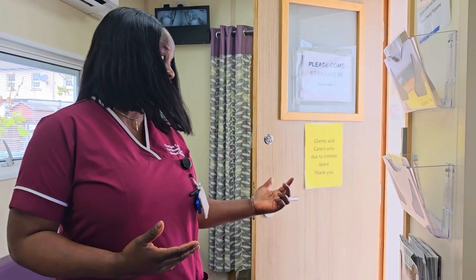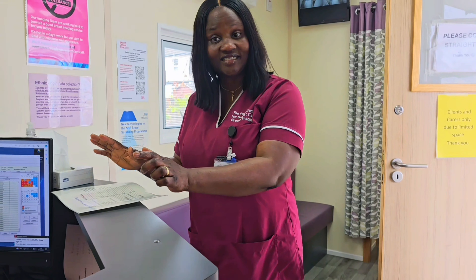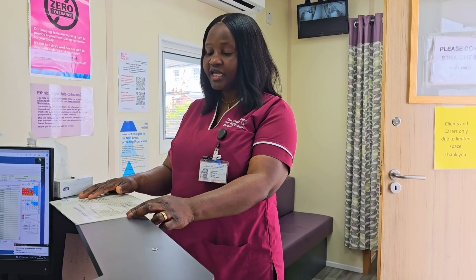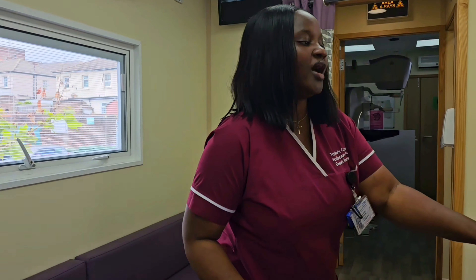When you come into the breast screening unit, you are first of all warmly greeted by a mammographer or a receptionist at the desk who would check your details and confirm you are due for a mammogram. They also ask for the last time you had a mammogram to be sure you are not having two mammograms within six months.